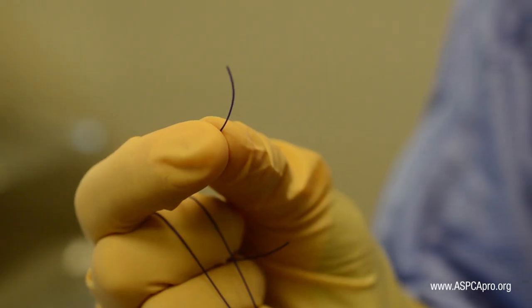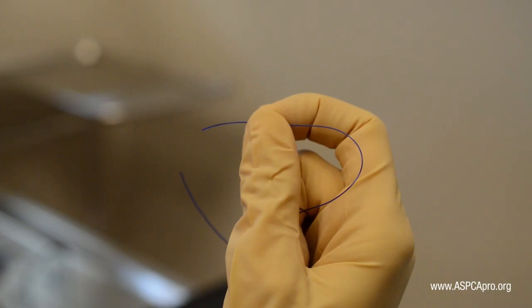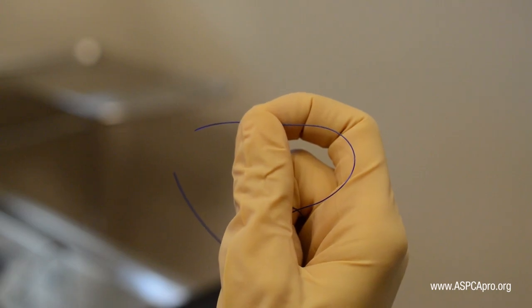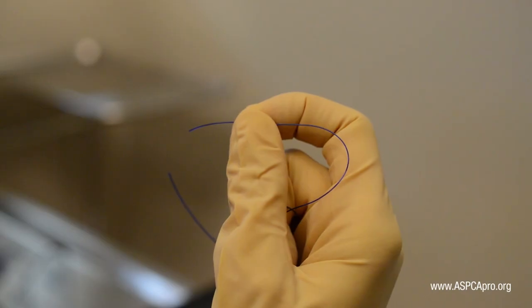Hold the suture collected securely in your dominant hand. The end section will be held between your thumb and forefinger with one-half to one inch extending away from your hand.